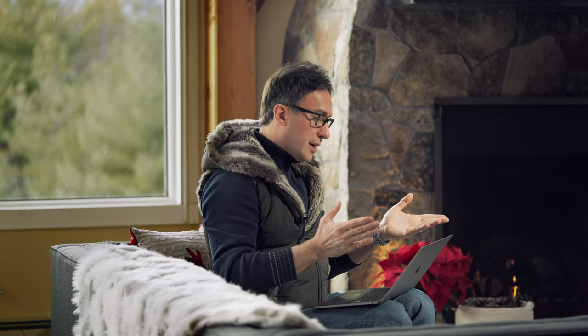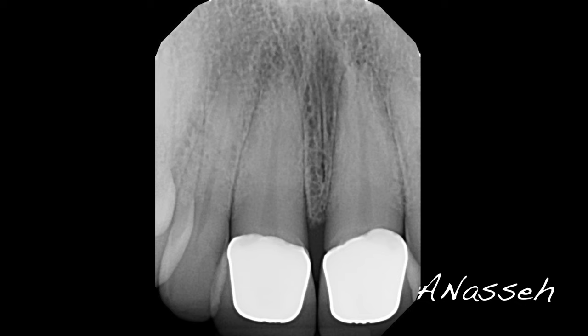For those using conventional instrumentation and wanting to treat in a single visit, proper apical gauging and physical cleaning of the apical three millimeters becomes even more important. Let me demonstrate with an example: tooth number 8, the upper right central incisor. This patient has a large apical lesion, the tooth is necrotic, and has a fairly large apical diameter visible on x-ray. It's a young patient with a history of trauma and existing crowns with marginal issues, with tooth number 9 also at risk from micro-leakage.